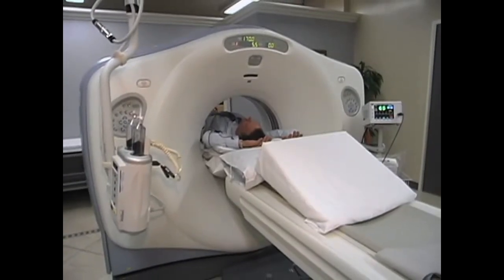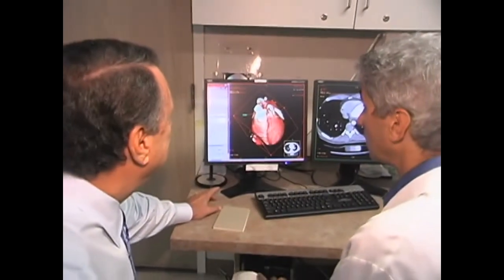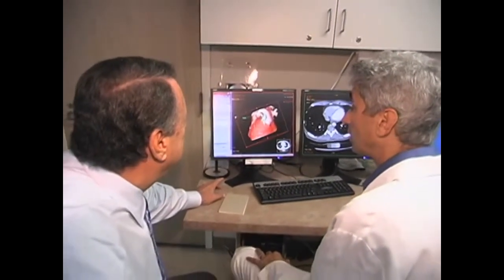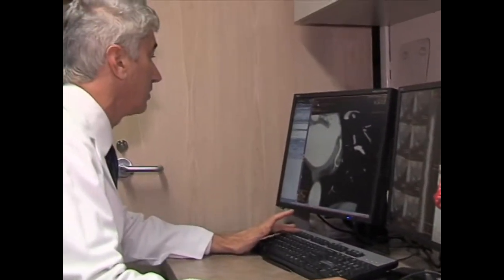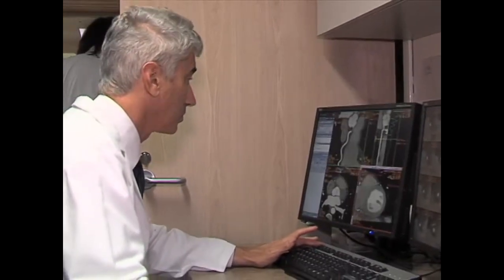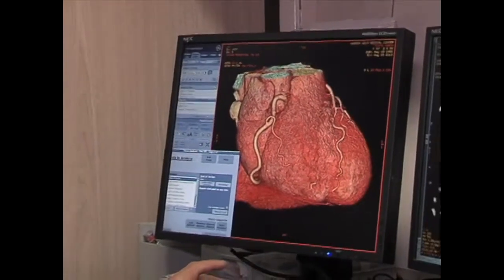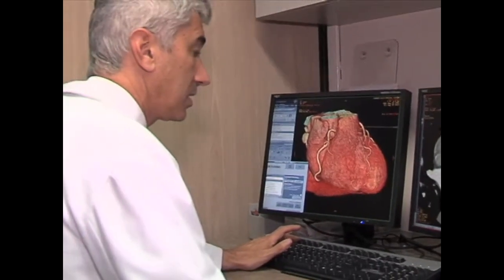We use a very specialized CT scanner that's fast, to take fast pictures of the heart, to freeze it, and then we can see the images accurately. And we look for calcifications first, and then we look for actual plaque and blockages as a follow-up. So we can now see not only is there calcified plaque, our original test, the calcium score, but now we can actually see, doing a non-invasive angiogram, whether there's a blockage in a certain artery, how severe it is, how much plaque is there, and then we can plan what the next step would be.